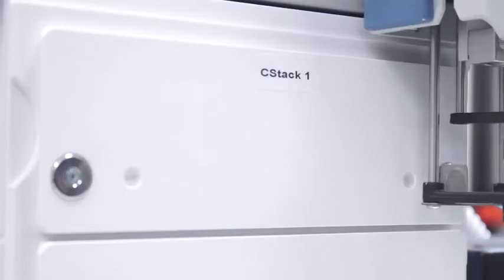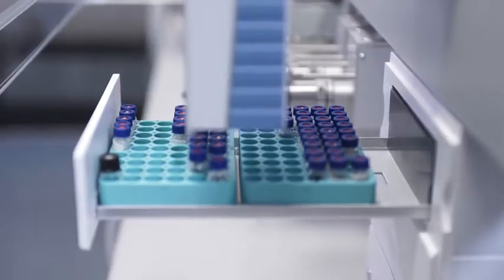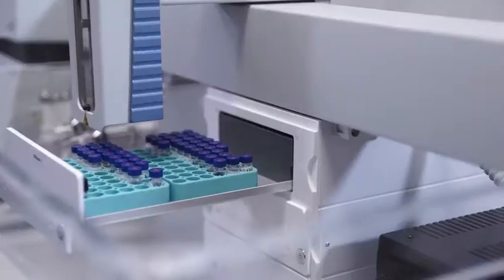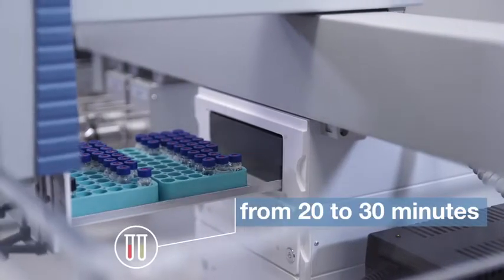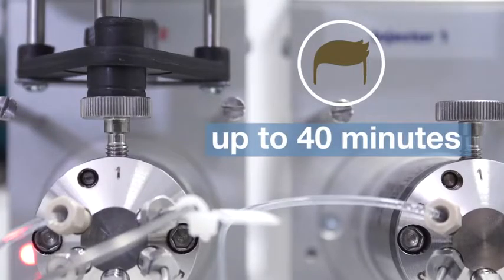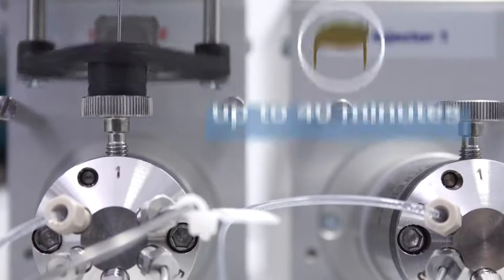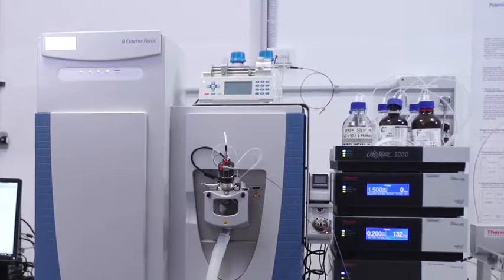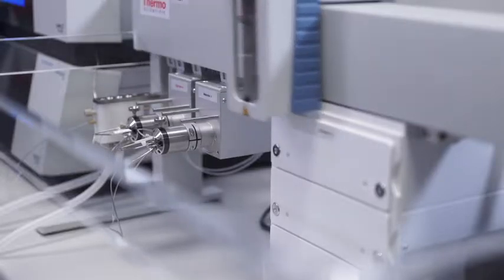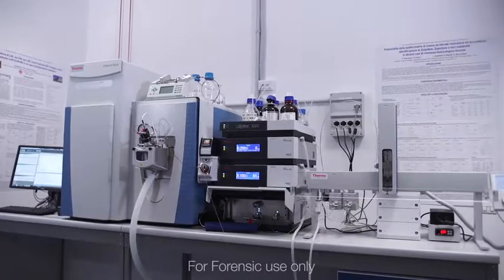Our total run time per sample, including processing and analysis, ranges from 20 to 30 minutes for urine and blood, and up to 40 minutes for solvent extraction for hair. Combining the power of UHPLC with Orbitrap HRMS has allowed us to develop a fast, comprehensive, and highly sensitive analysis of various drugs of abuse compounds.